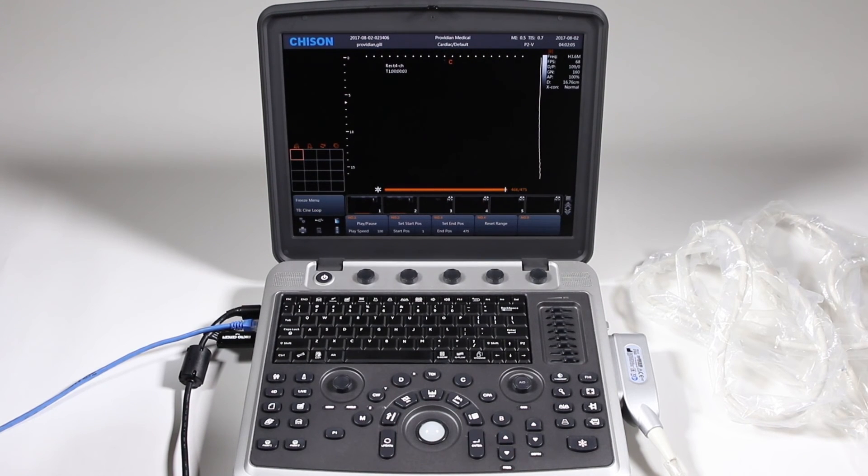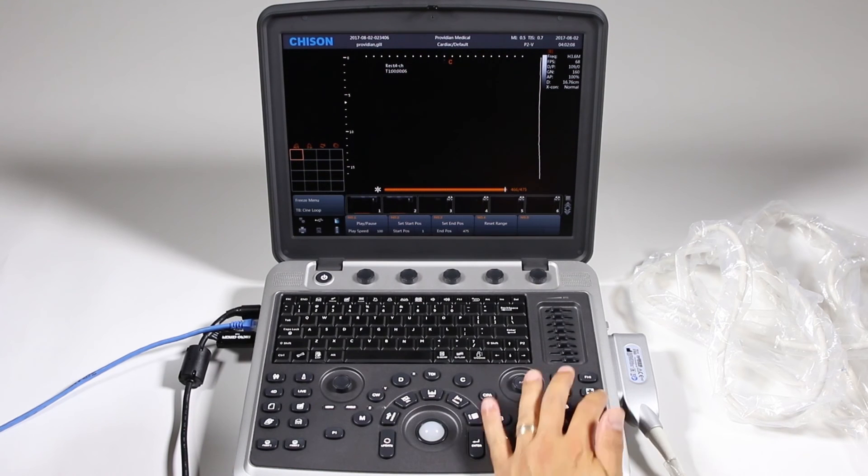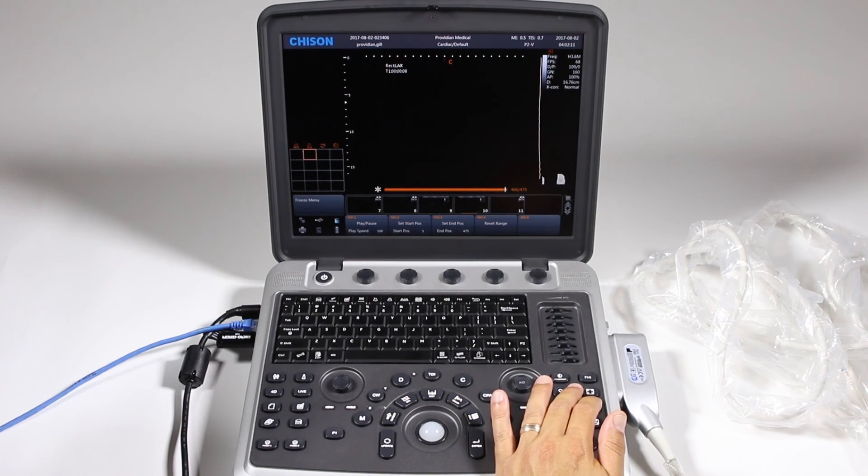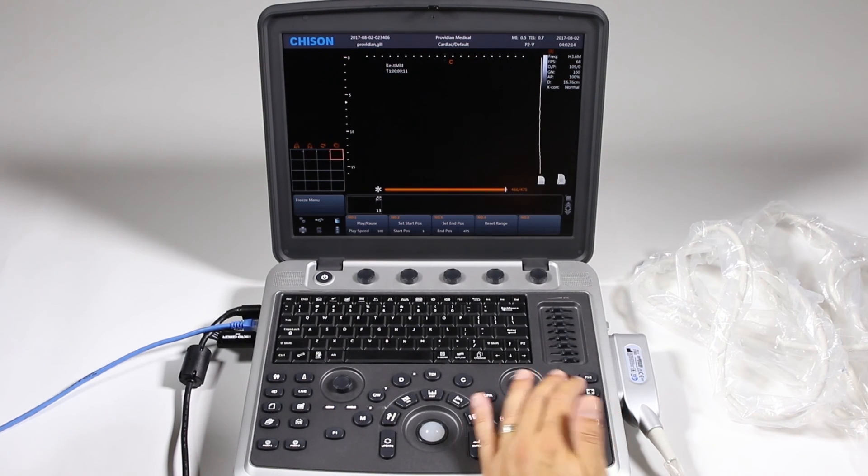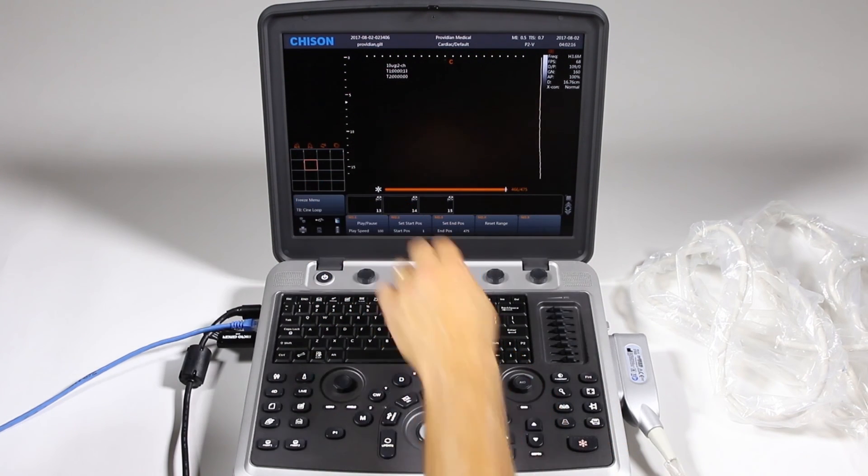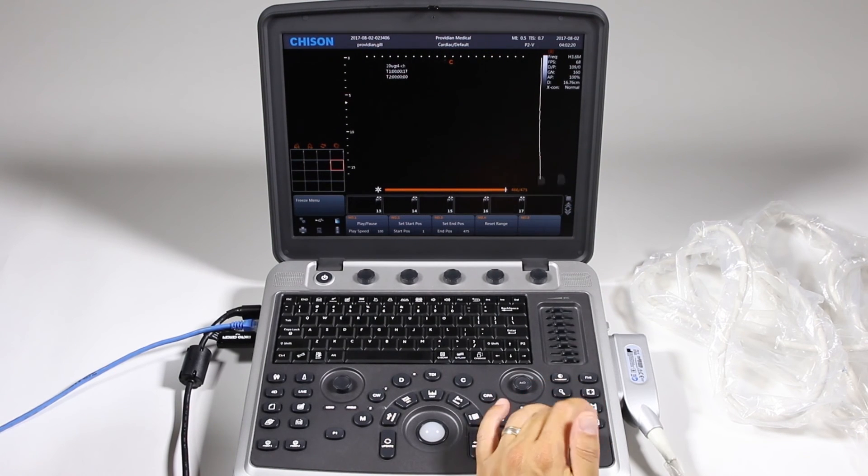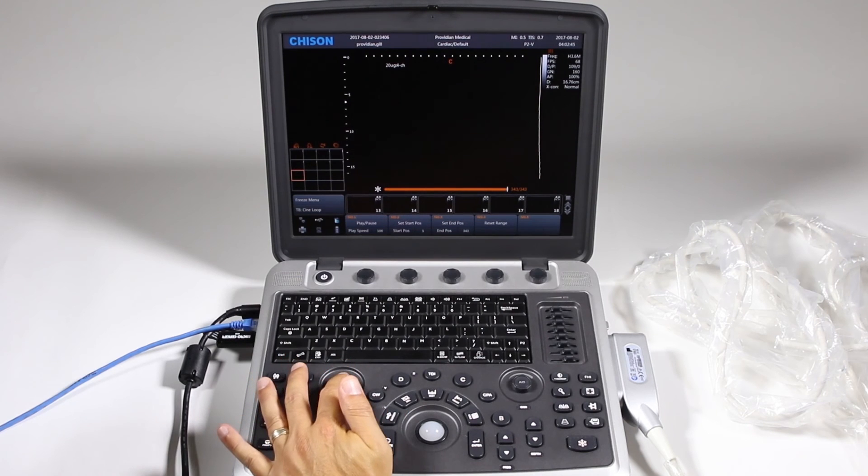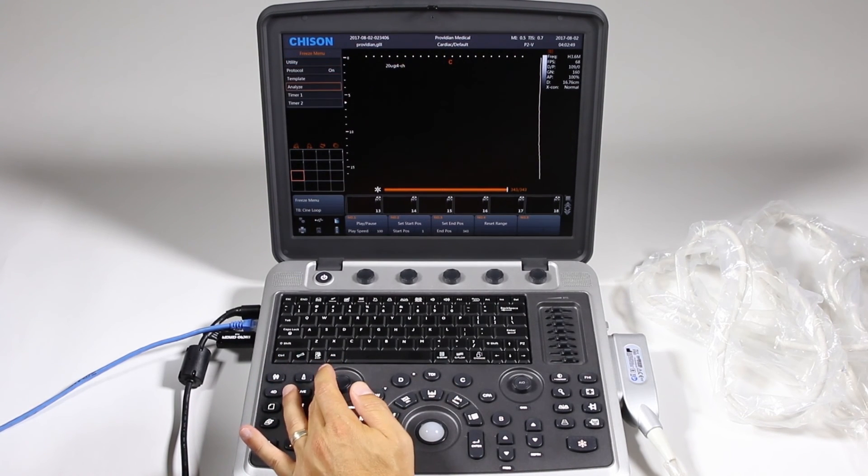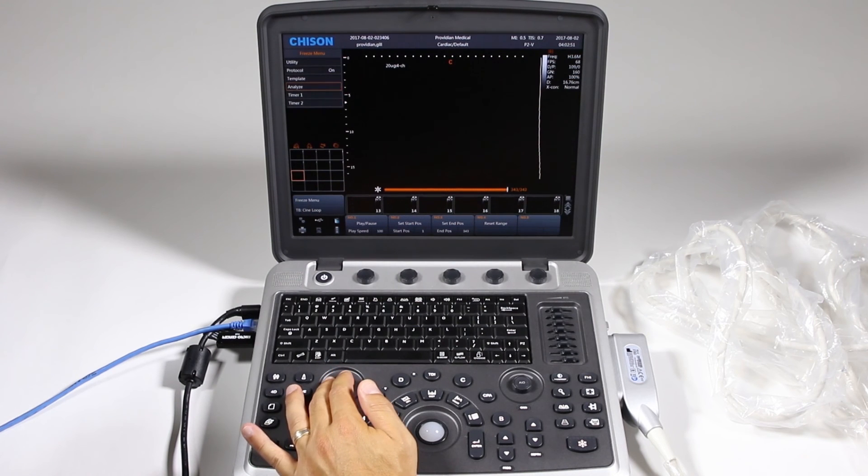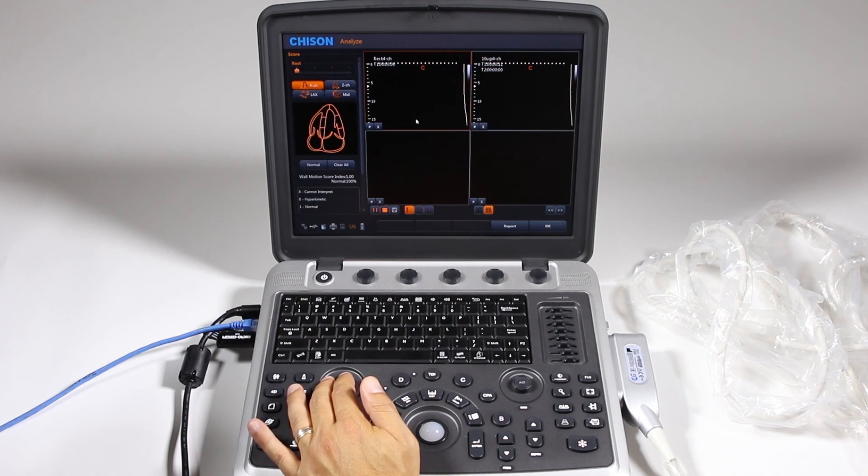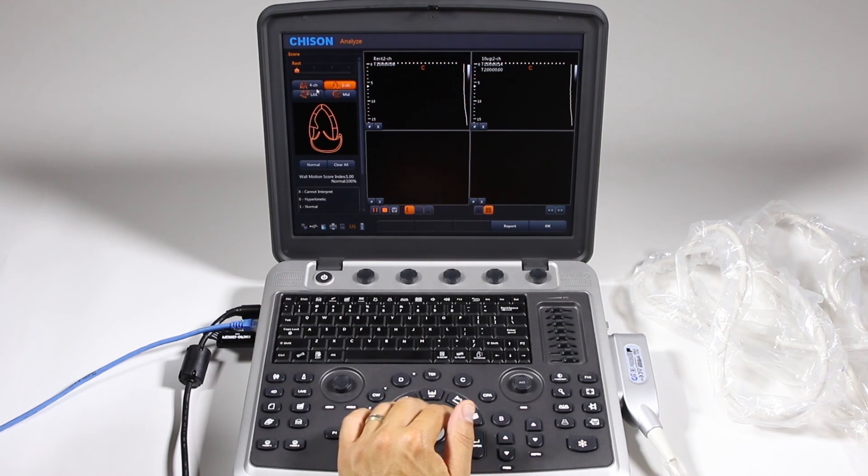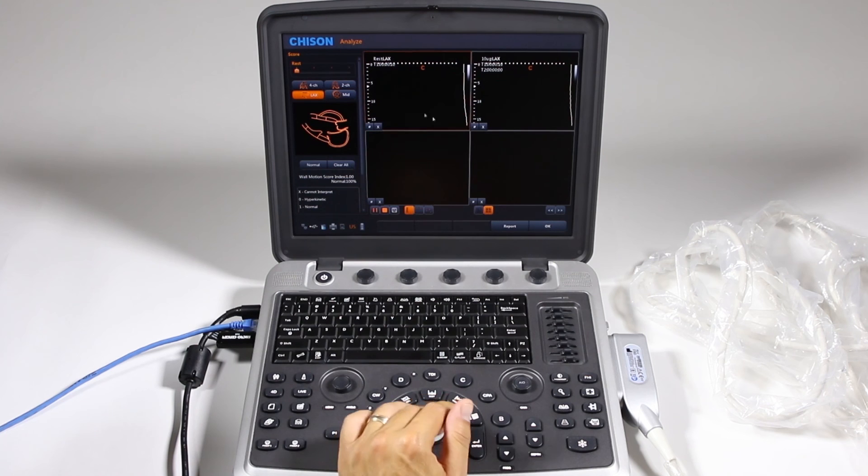And it's not something I can show you right now without an ECG attached, but I can go ahead and hit save each time on these images. If you don't have the ECG you can go ahead and hit save and it will go through the various protocols there. And when I'm done I'm going to press that menu button down again. And here I can analyze, change timers, etc. Click on analyze and it will pull it all up and you can view it in various sections there.